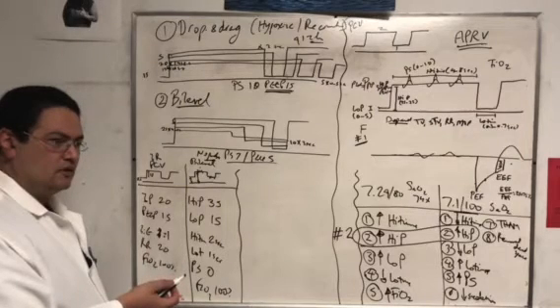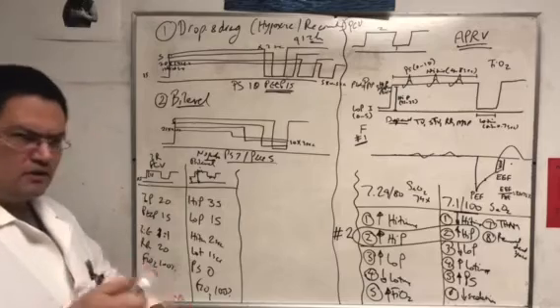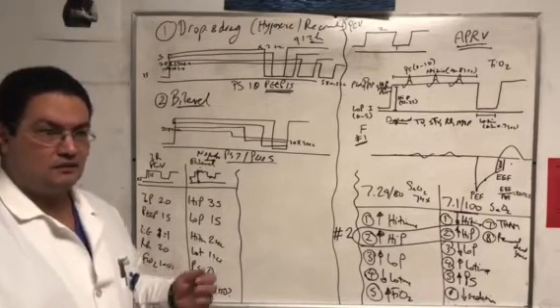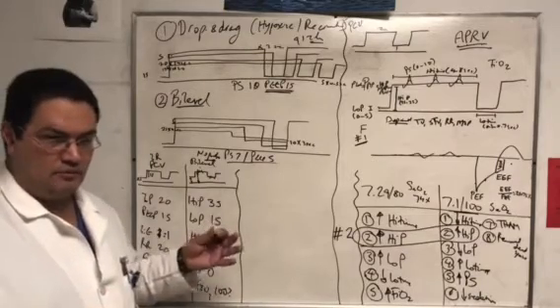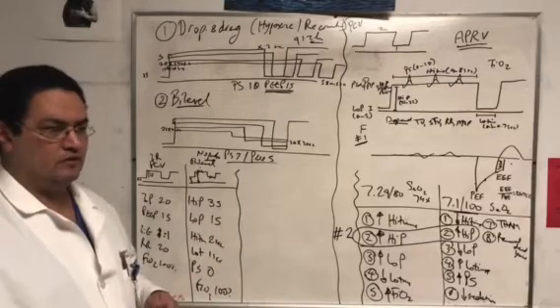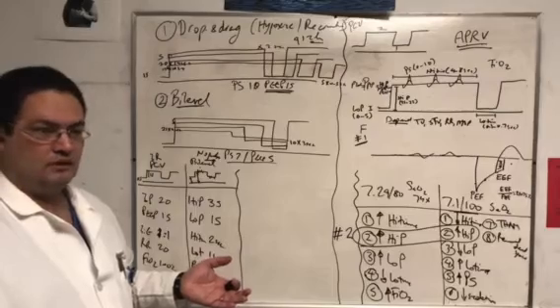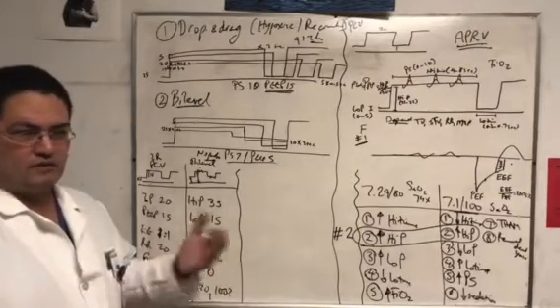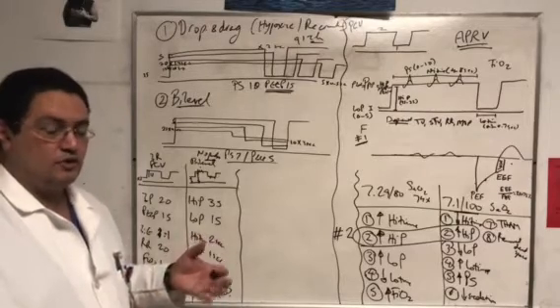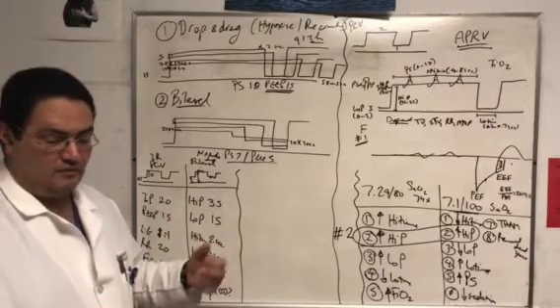And then at some point we noticed that the respiratory therapists are telling us that multiple patients, one after the other, did not tolerate even the SAT. Like you put him on SAT, which is a wake up, no SBT yet. He breathes in the 50s, okay. So put him back on the vent. Another one, 50, another one, 50, another. So we investigated what's happening, and it turned out that there's an inherent issue. We know about it, but we didn't know that it's that common to happen.